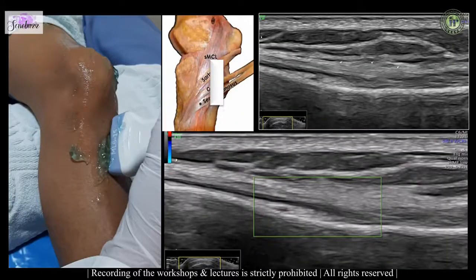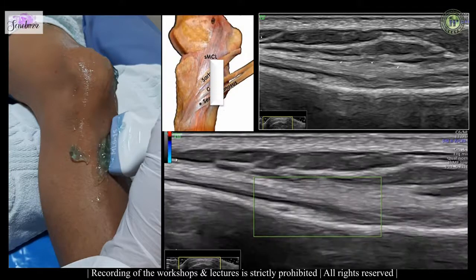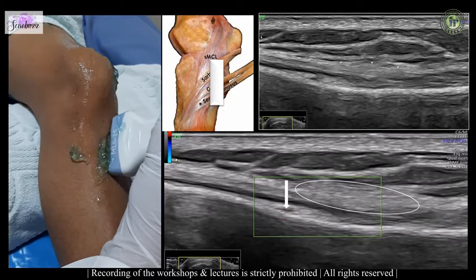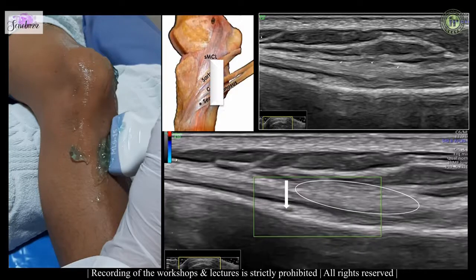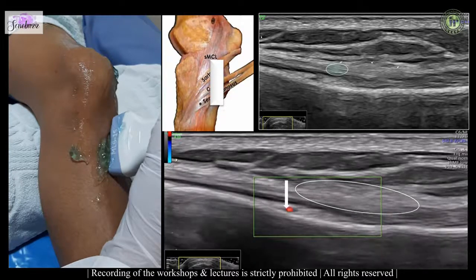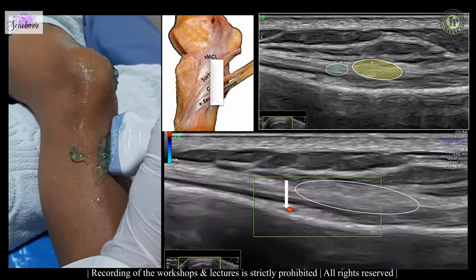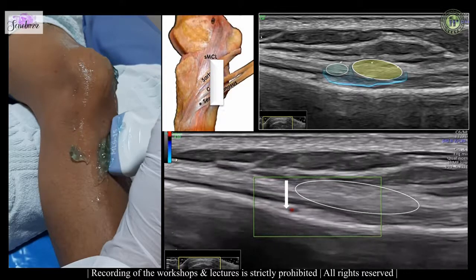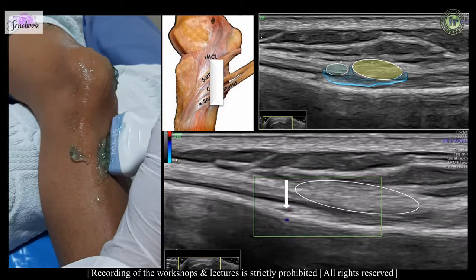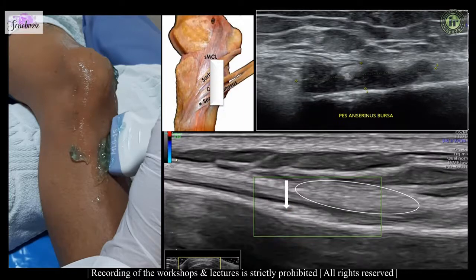Lying between the distal MCL and the anterior tibial concavity, we have the medial genicular artery and nerve, and that actually serves as an important landmark to identify the pes anserinus tendons that lie anterior to the MCL. They are actually intermingling fibers of the sartorius, gracilis and semitendinosus getting insertion just anterior to the MCL into the proximal tibia, and we have the pes anserinus bursa there between the bone and the tendons. It's usually not seen in ultrasound unless it gets inflamed with some infection or inflammation.